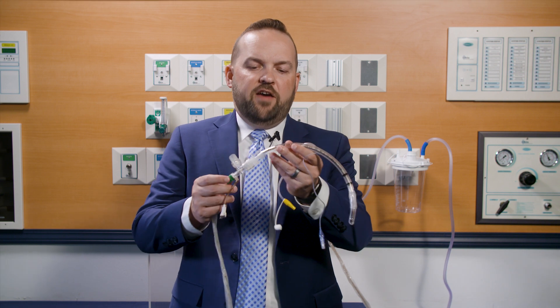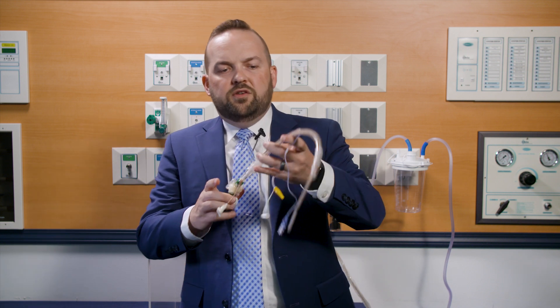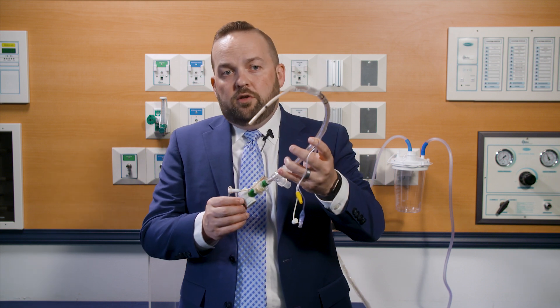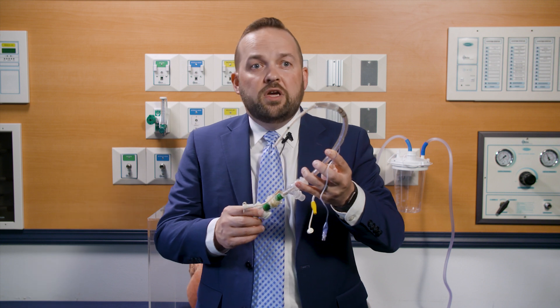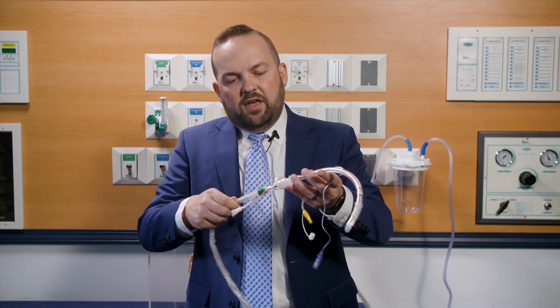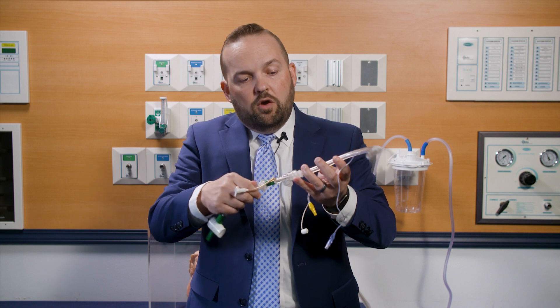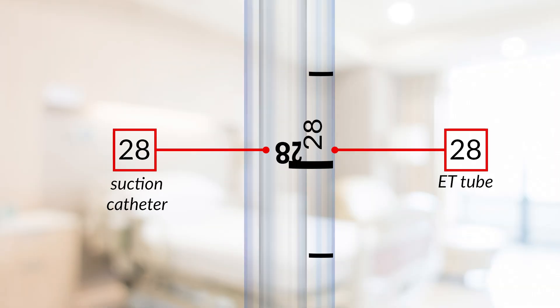Here I have a standard 7.5 millimeter endotracheal tube and a 14 French suction catheter. If you bury the catheter all the way to the hub, you'll see several centimeters sticking out of the end of the tube — that's guaranteed to come into contact with tracheal tissue, possibly going into the right main stem. Rather than doing it that way, you should insert the catheter noting that there are centimeter markings on both the catheter and the endotracheal tube. When you match those up — here I've matched the 28 centimeter markings — you'll see the tip of the tube is just at the end of the catheter, ensuring you won't come into contact with tracheal tissue at all.